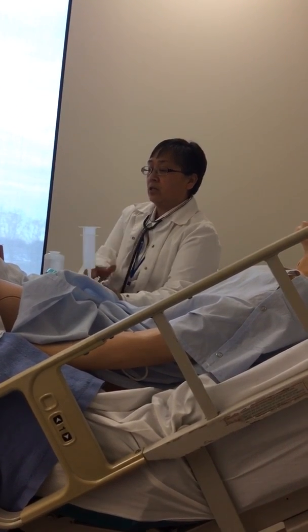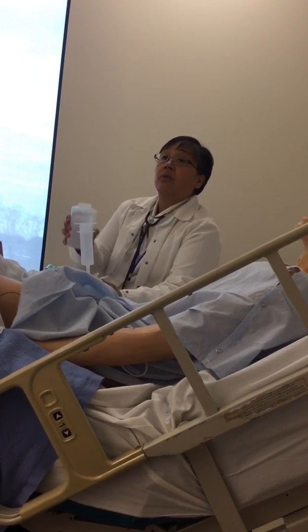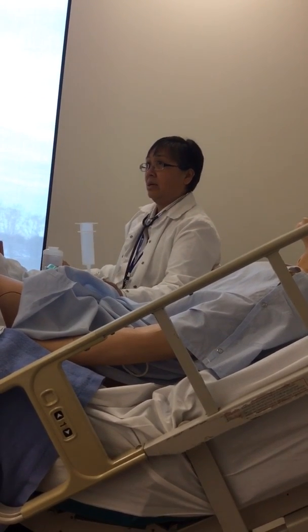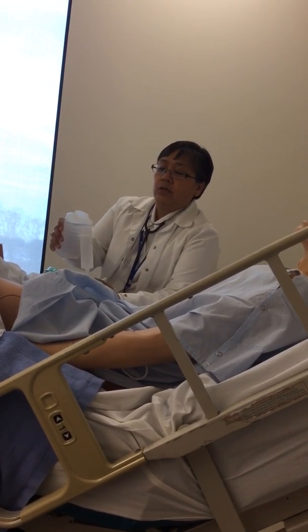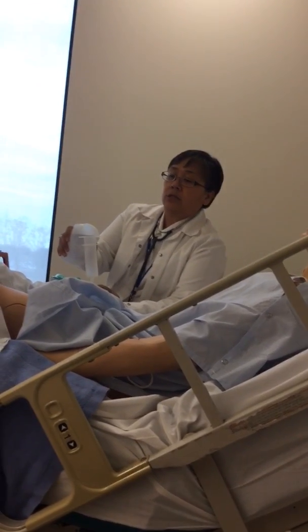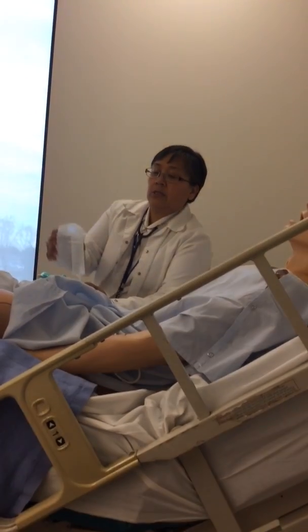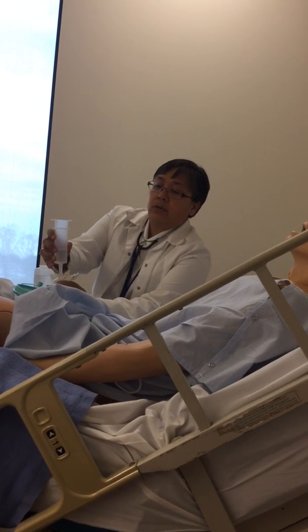Once I see the medication go down, I'll take my next cup, pour it in. So I'm not giving and mixing them all up, okay? I'm giving time in between. Then the very last one, you're gonna flush it with 15 to 30, it says in your checklist. So let's say I put in 30 cc's. Just letting that go in.